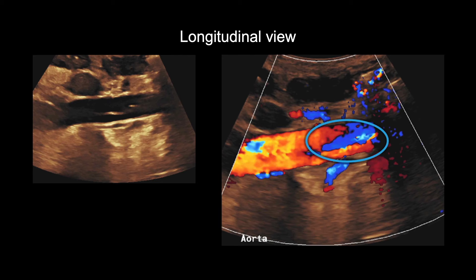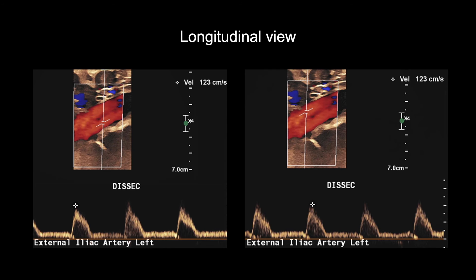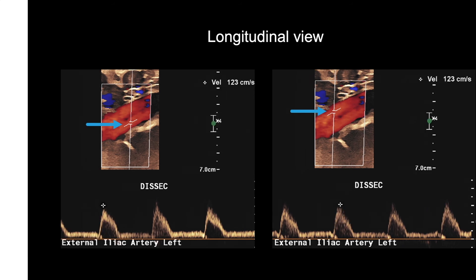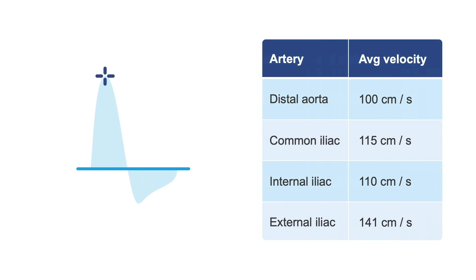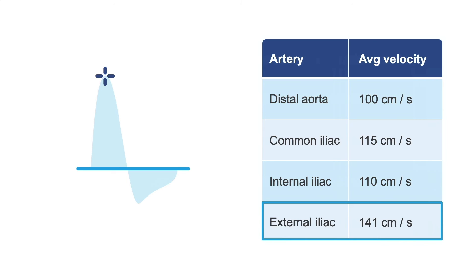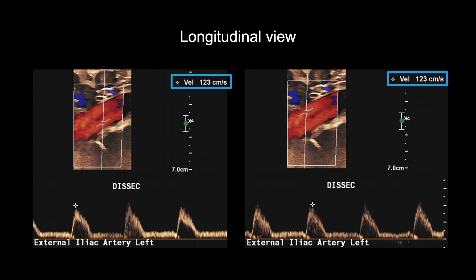As color is added, you can see the flow separation confirming the dissection flap. This separation of color is often seen in dissections on ultrasound. When encountering a dissection, document peak systolic velocities on either side of the bright line in longitudinal to be sure that they are not elevated. This would indicate a hemodynamically significant stenosis affecting blood flow to the organs and legs. The normal average velocity in the external iliac artery is 141 centimeters per second, so at 123 centimeters per second, these images show no significant velocity elevations.